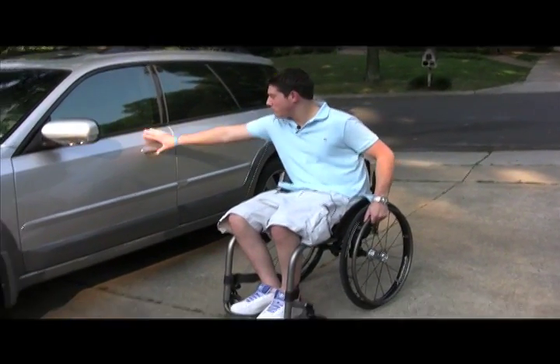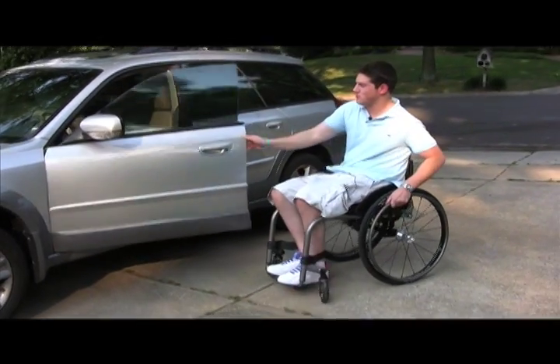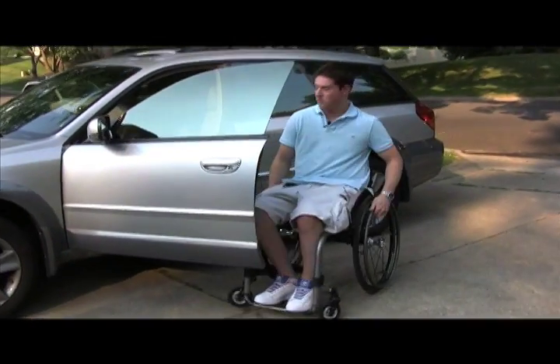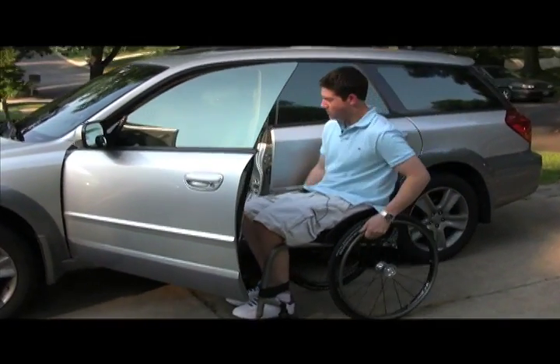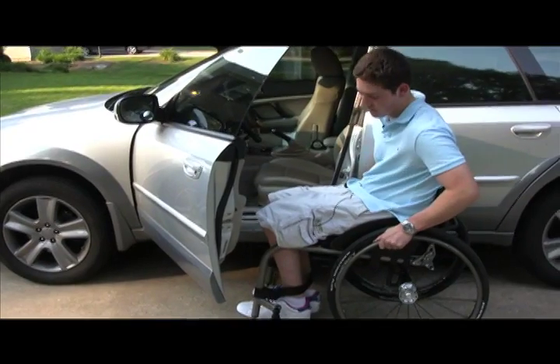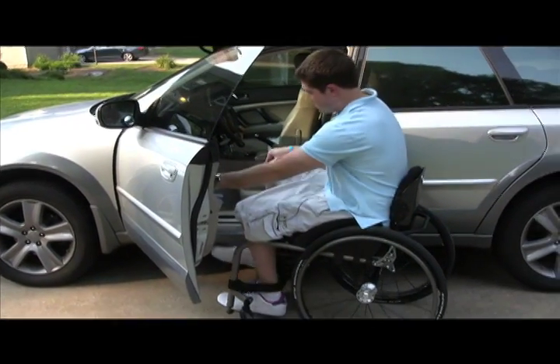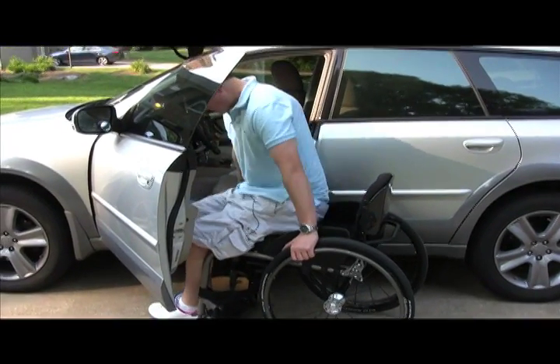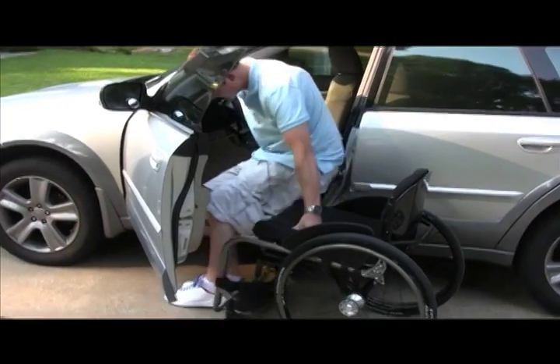I basically just roll up to the car, open the door. You don't want a car with too heavy of doors because it'll make it a little bit harder, but if you get over here, you'll see how I transfer. I just come up, I like to put just one brake on, the right brake. That makes it easier in the later scheme of things. I'll show you why. You just flop your legs off and do an easy transfer.